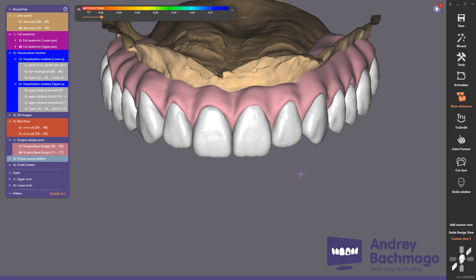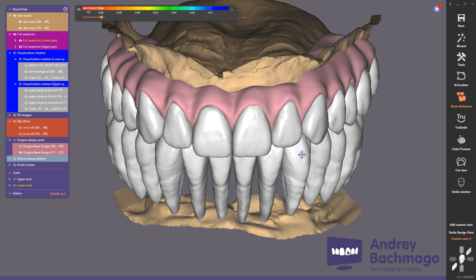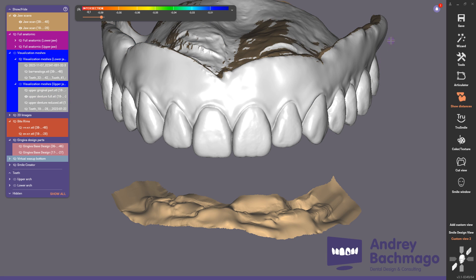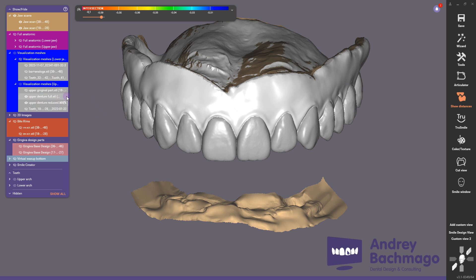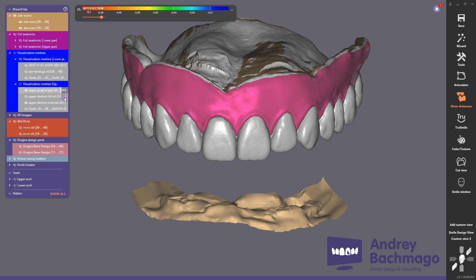Next we need to prepare the upper prototype of the denture. I created an upper jaw prototype that replicates the denture with the newest teeth and gingiva. I also prepared a version with a reduced gingiva area and a segment for the gingiva which can be printed separately and connected to the denture.